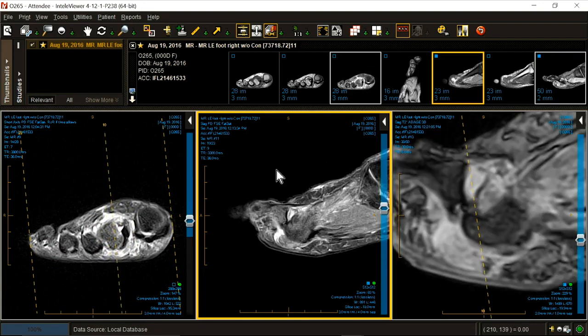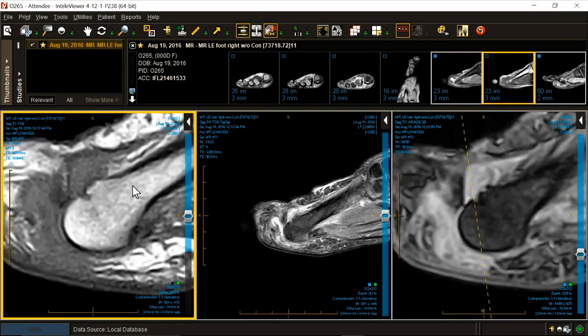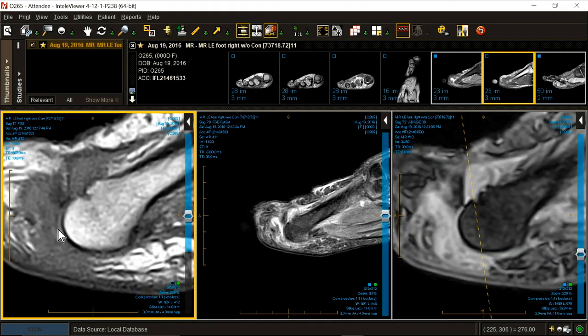Really not much of a secret, is it? Here's the second toe. Where's the plate? That's a piece of plate. That's about all you got. So when we tape the toe back, the metatarsal flopped right out of there.